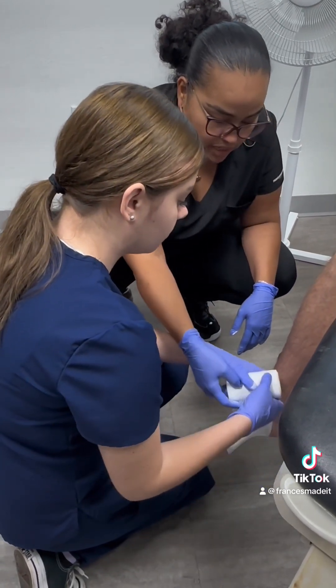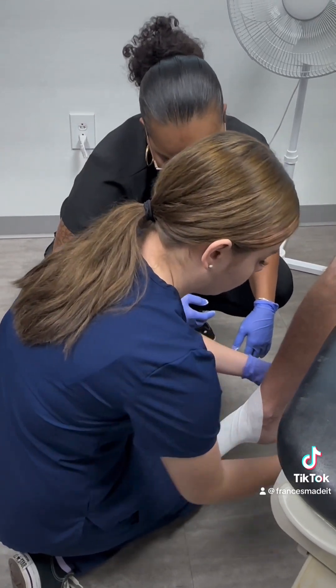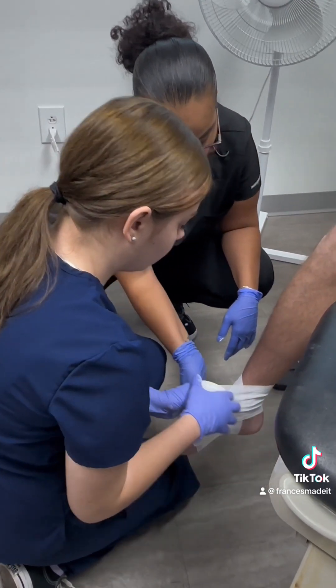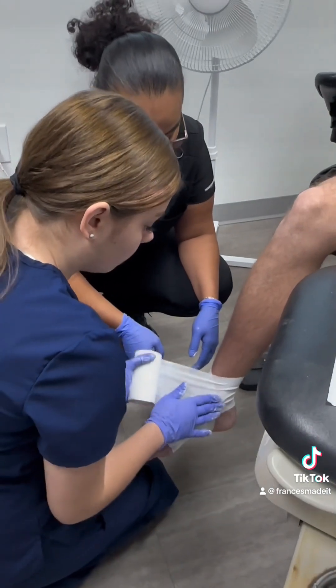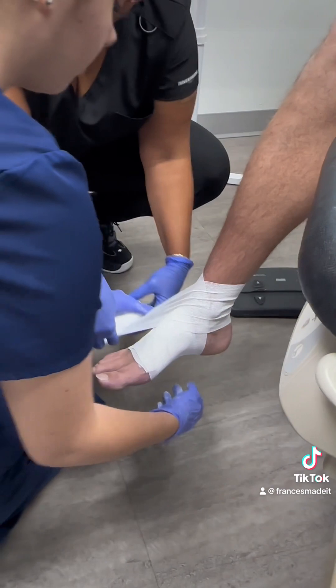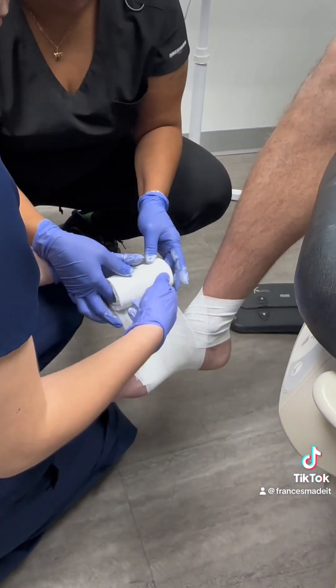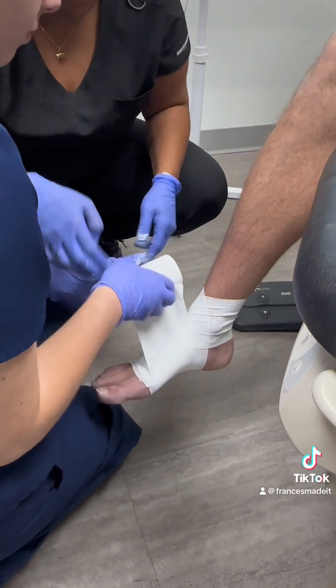You're going to bring it up and do a figure eight around that ankle, come down to your midfoot again, wrap it around. Keep your ankle — let it do what it wants to do right now. Start your folds right here.